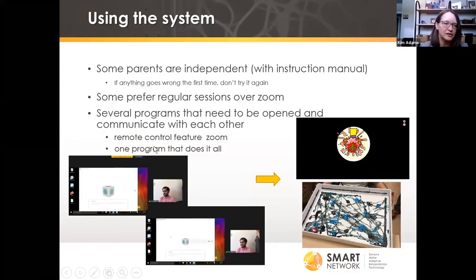So first of all, what you need to do if you had it all in separate steps is use the Emotiv program to train: what does my brain do when it's not trying to make an action? What does my brain do when I'm imagining pushing this block further away?